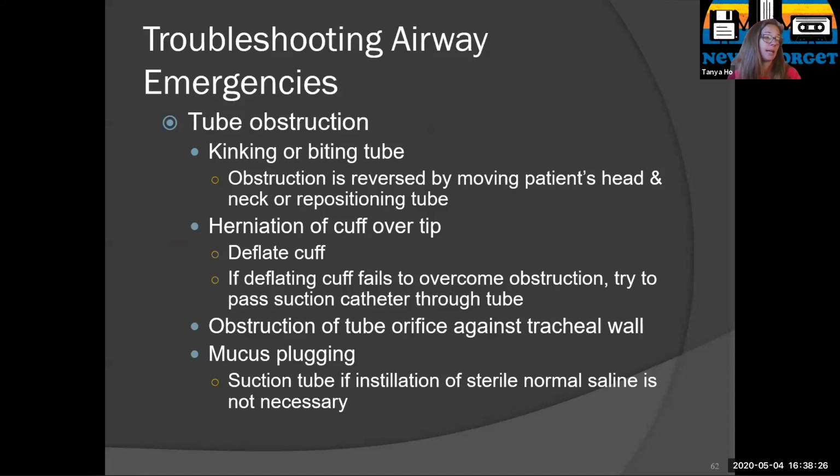Okay, so this is the exact same slide as the tracheostomy slide. So tube obstruction, a kinking or biting of the tube, that's patients when they wake up. We also have bite blocks that we can insert if they are biting down, because again, they're sedated, they're not really knowing what's going on. So they're going to bite because there's something there, and that's just a natural reflex. So we can insert a bite block to help with that.